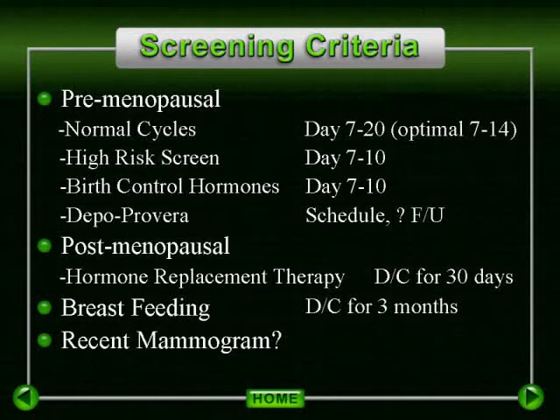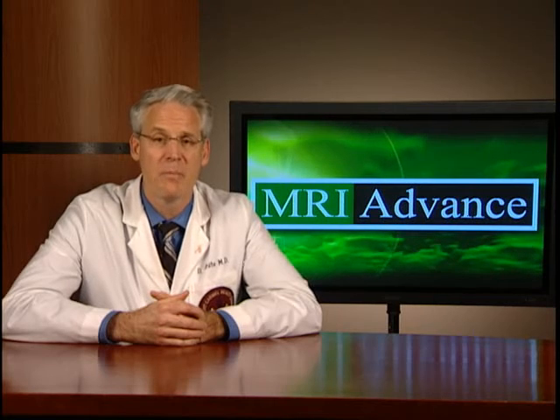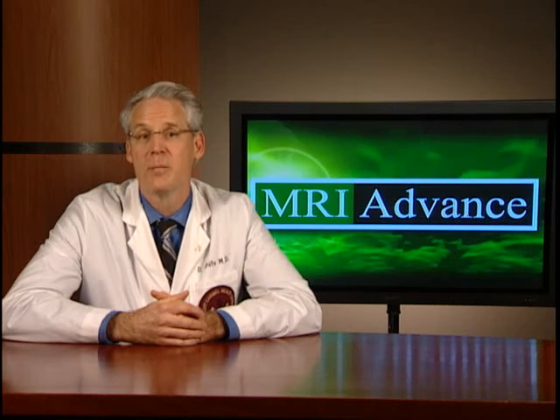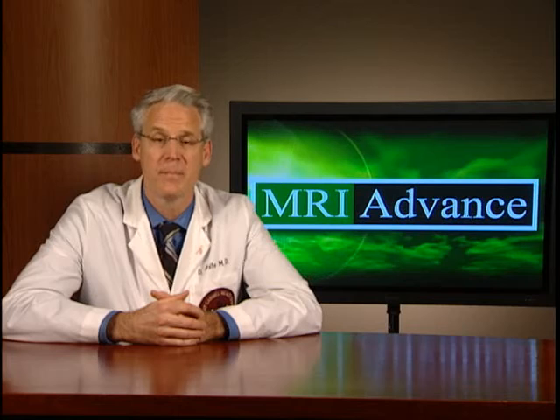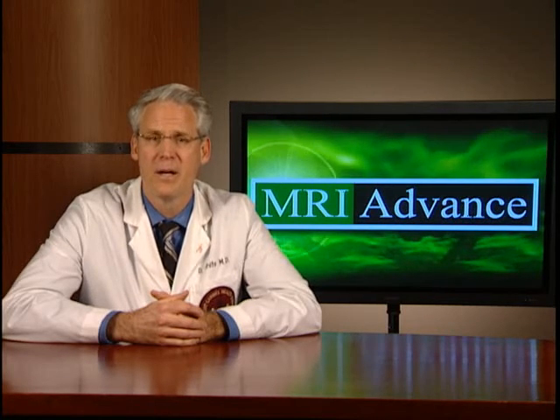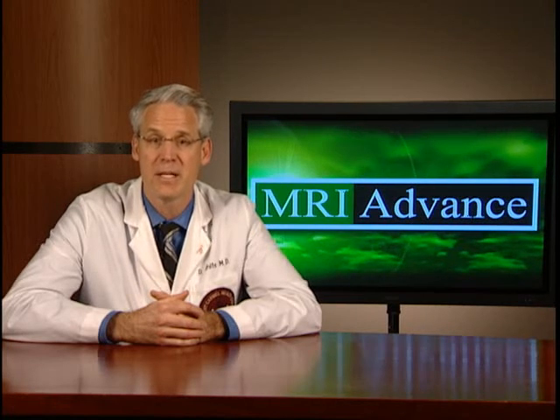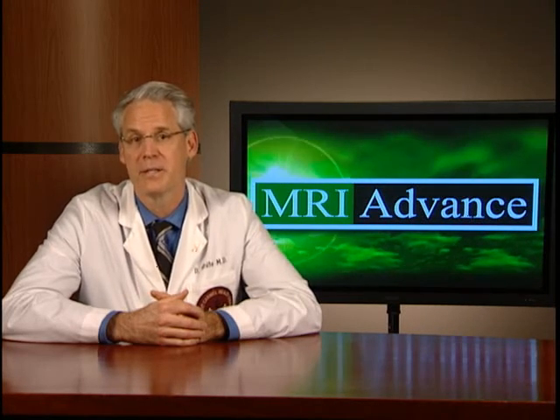At the time of scheduling, information as to the patient's most recent mammographic and/or ultrasound exam should be made. These must be available at the time of the MRI interpretation, and if they are performed at an outside institution, please instruct the patient to bring them with them. If the patient has not had a mammogram within 1 year, our technologist will generally not schedule the exam until the situation has been discussed with one of the radiologists.